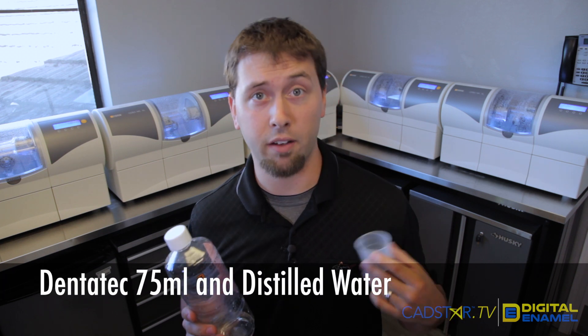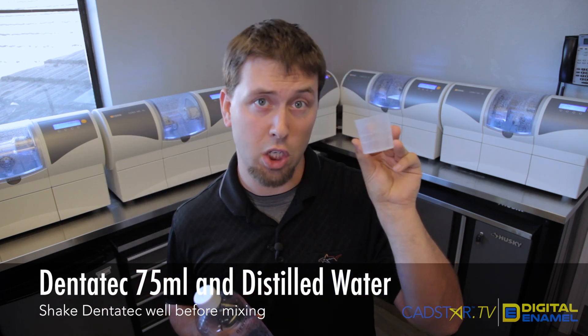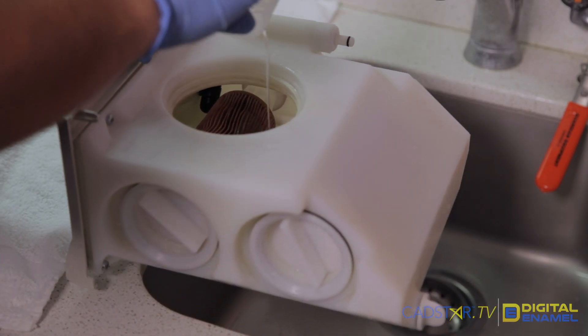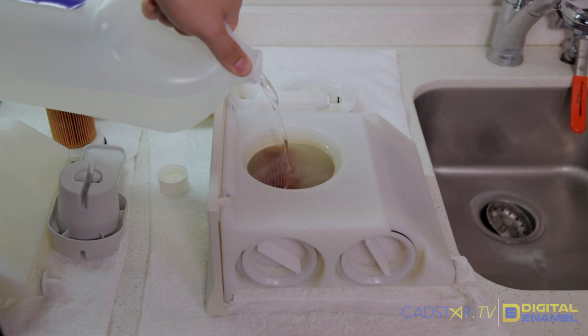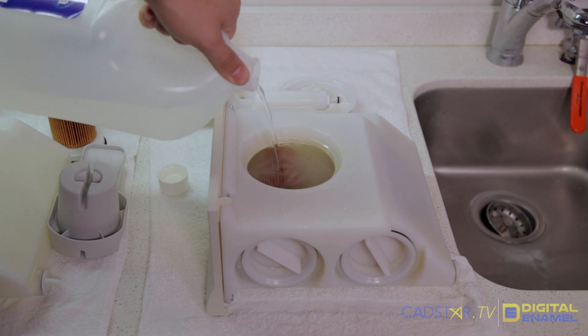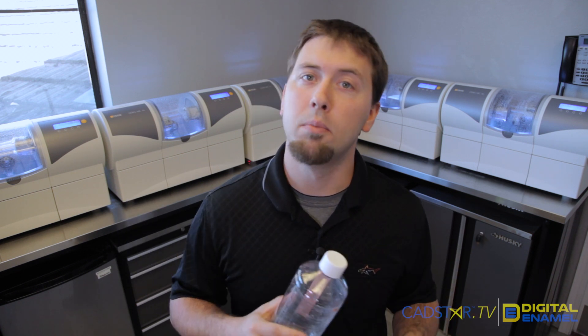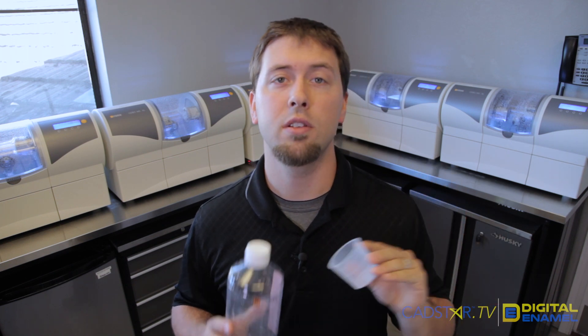Sirona recommends using 75 milliliters of Dentatec for each tank full. Shake it really well and fill it to the top line on the cap. When you fill the tank, use Dentatec and distilled water — if you stick to that ratio, you should never have any problems. If you're a lab milling non-ceramic materials, double check whether you need to change your ratios. Otherwise, 75 milliliters and you're good to go.